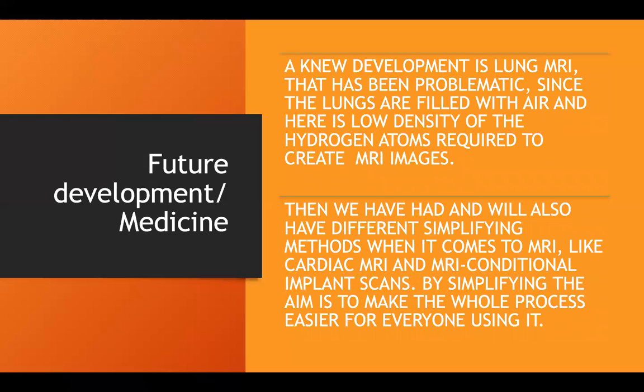Then if we look at the future development, a new development is the lung MRI, which has been problematic since the lungs are filled with air, and in the lungs there is a low density of the hydrogen atoms required to create the MRI images. And then we have had and will also have different simplifying methods when it comes to the MRI, like cardiac MRI and MRI conditional implant scans. By simplifying, the aim is to make the whole process easier for everyone using it.